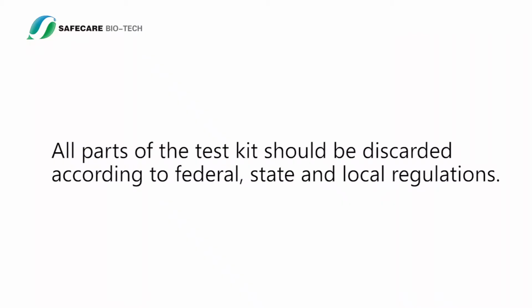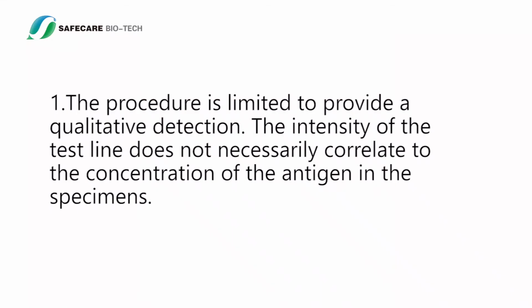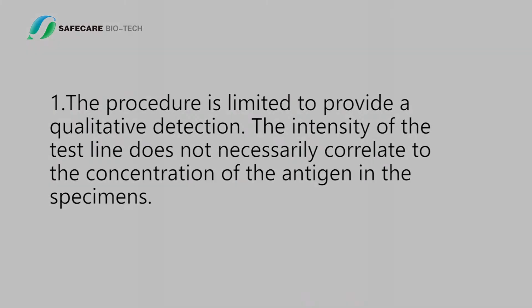Disposal. All parts of the test kit should be discarded according to federal, state and local regulations. Limitation of the test. The procedure is limited to provide a qualitative detection. The intensity of the test line does not necessarily correlate to the concentration of the antigen in the specimens.